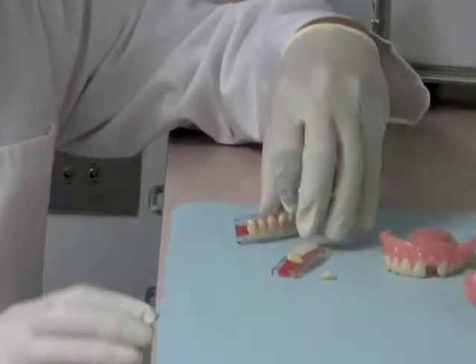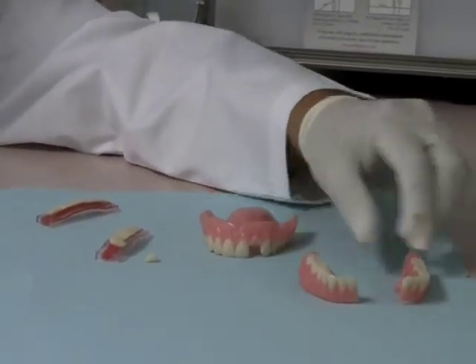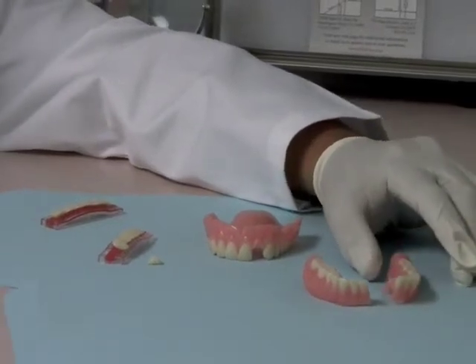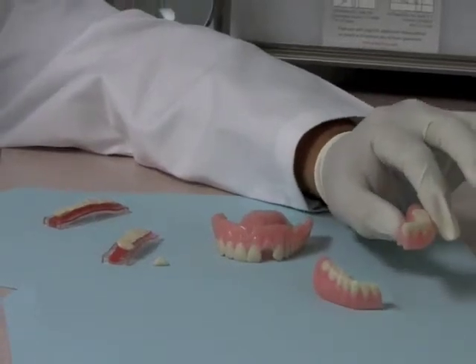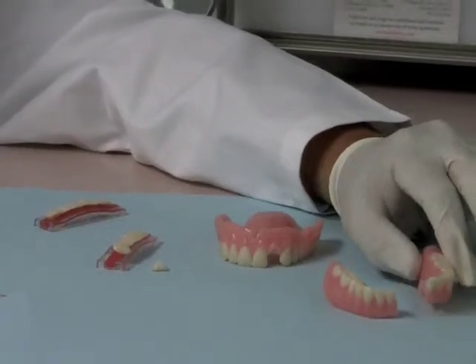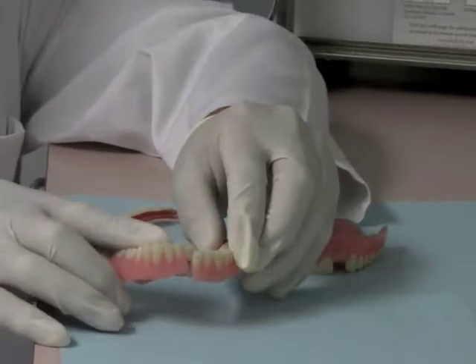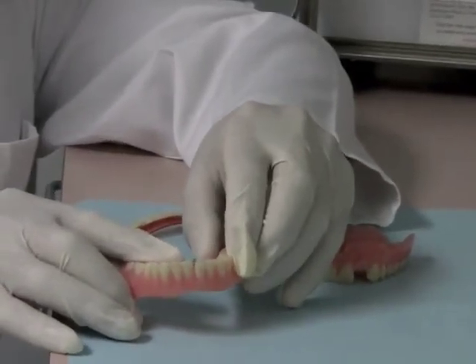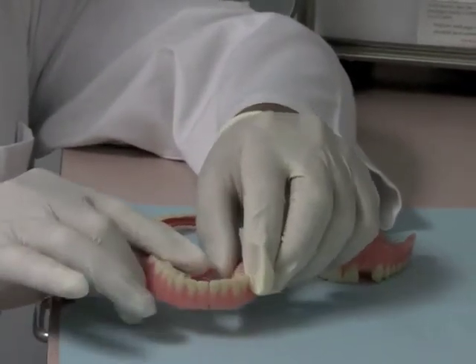The second most common problem is when the denture literally splits in half. This happens a lot of times when the patient will drop the denture, or the bite or the denture is not stable, and the denture will literally break in the mouth. So when that happens, if the denture cannot be repositioned correctly, a new impression will have to be taken in the mouth, then the denture can be repaired.